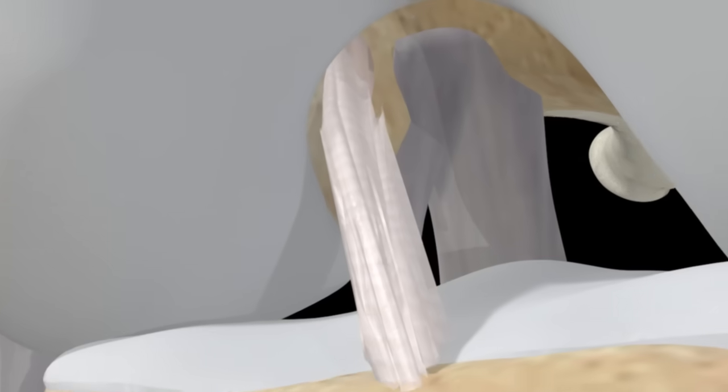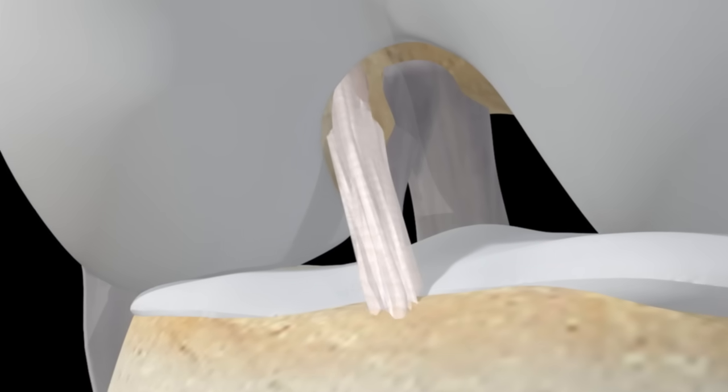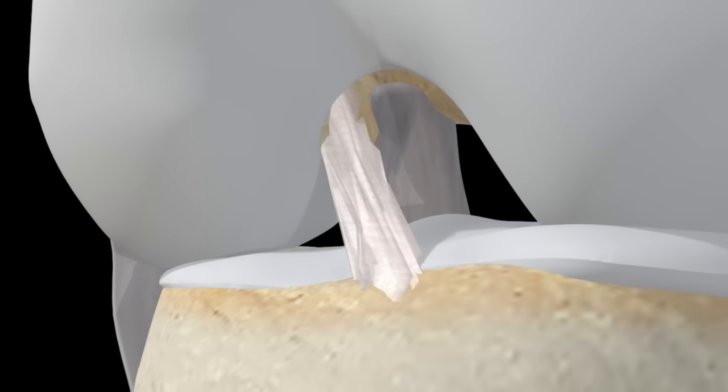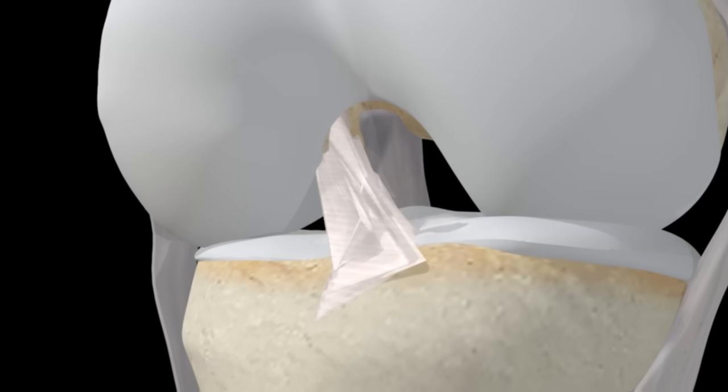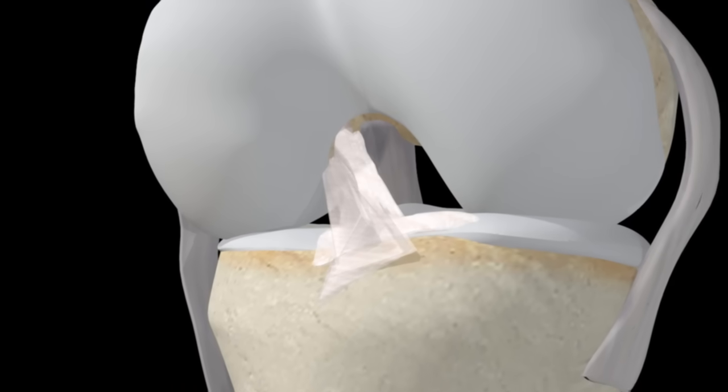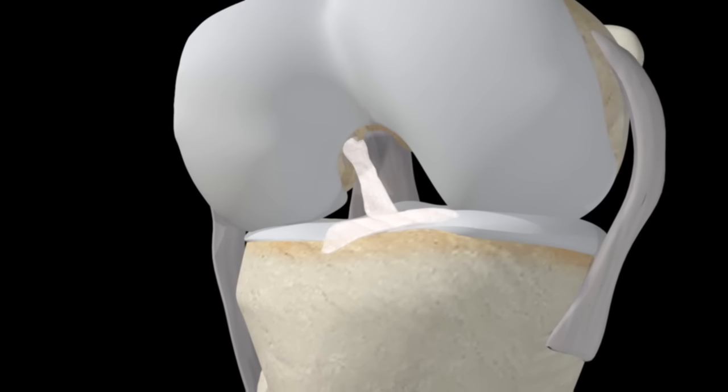The graft from your hamstring tendon will act as a scaffold upon which a new ACL will grow. Over time, the hamstring graft undergoes changes and is strengthened, leaving a strong, viable ACL.